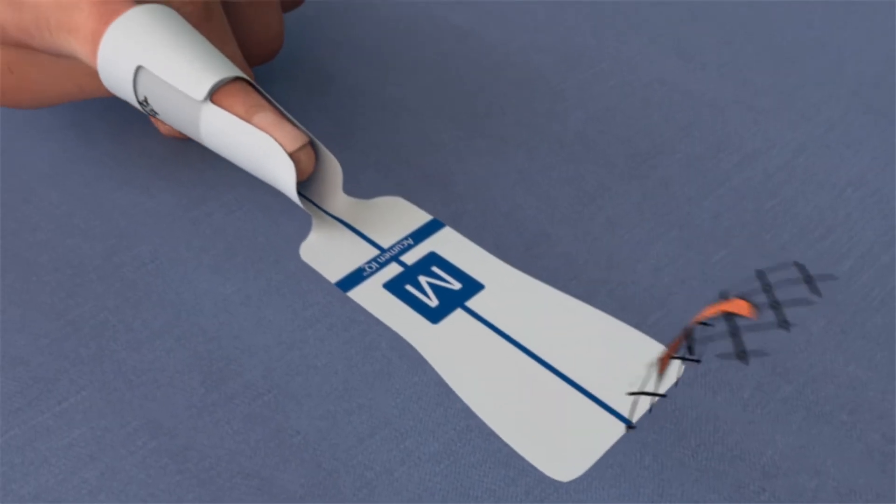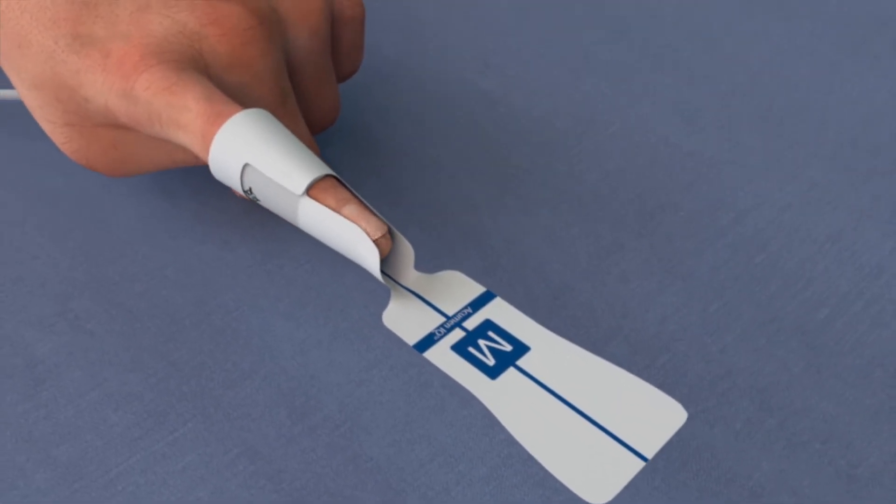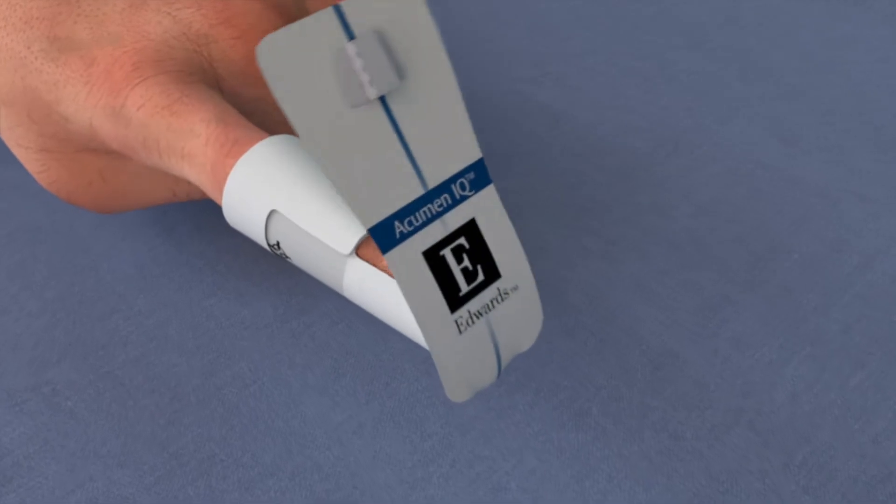Remove the adhesive backing from the distal end of the alignment tab and secure to the top of the finger cuff.